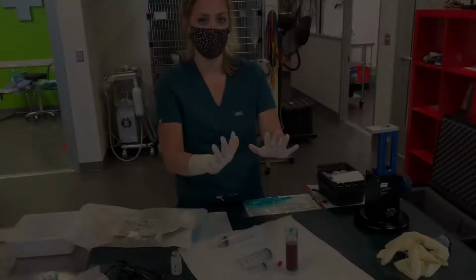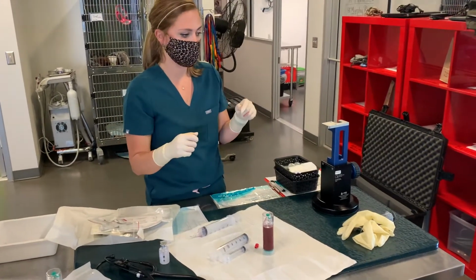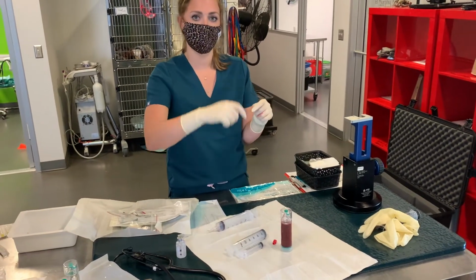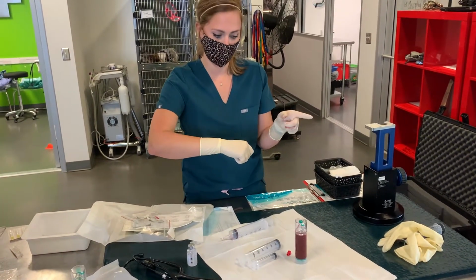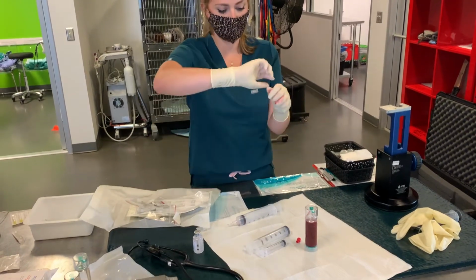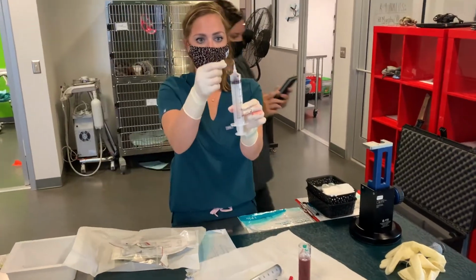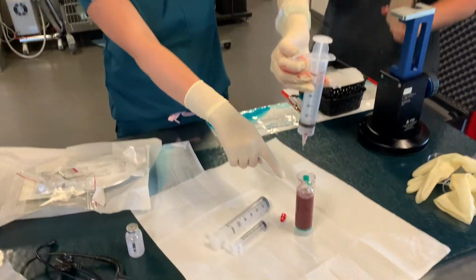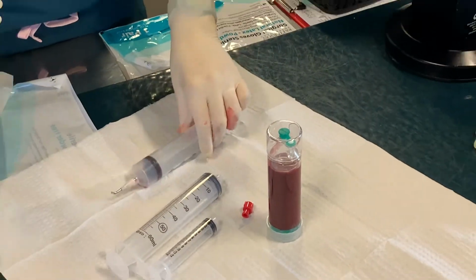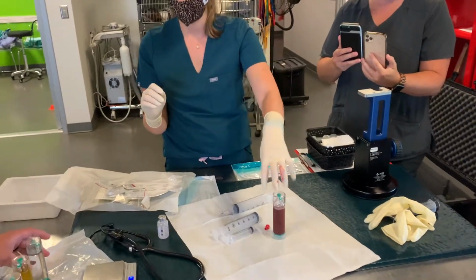Perfect. Okay, catch you up. Here's what we just did. Sterilely, the person that's drawing the blood, we put a butterfly needle into the jugular vein. We used a sterile syringe to draw 60 mils for this patient. And then the person that draws the blood has sterile gloves on, takes the needle off the syringe, puts a dispensing needle that looks like this on top, and then that fits directly into this tube and pours the blood in without creating any foam and bubbles. And then you put the green top and then the clear cap on there.